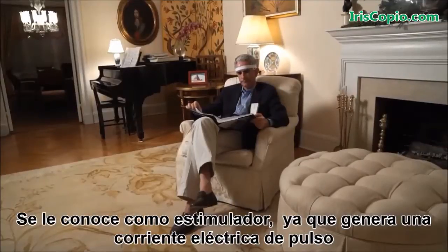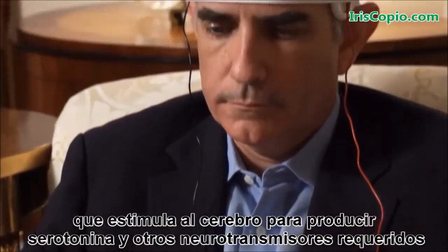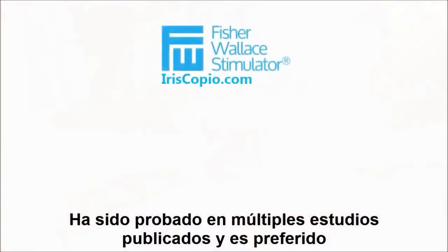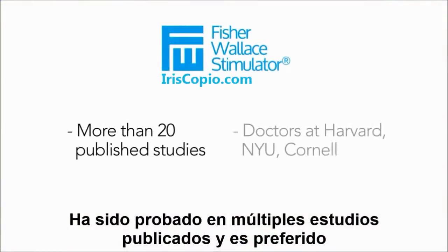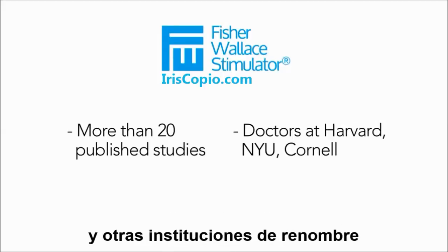It's called a stimulator because it delivers a gentle electrical pulse that stimulates the brain to produce serotonin and other neurochemicals required for healthy mood and sleep. It's been proven in multiple published studies and is preferred by doctors at Harvard, NYU, Cornell, and other top institutions.